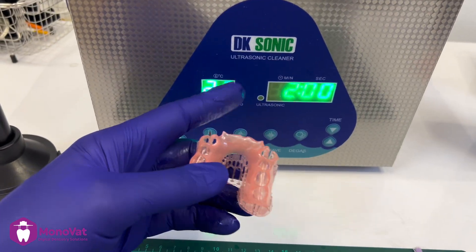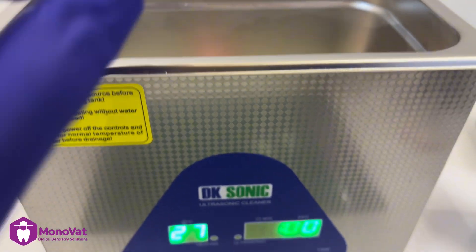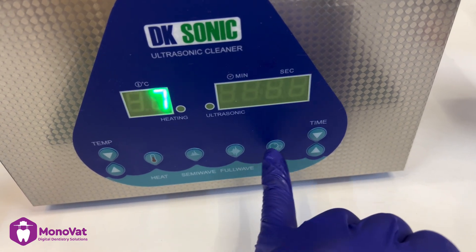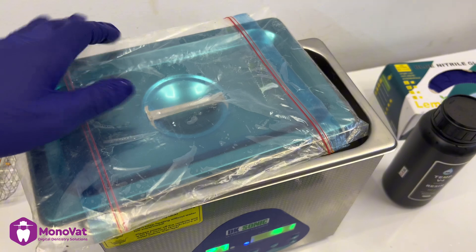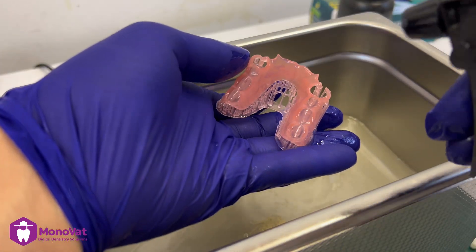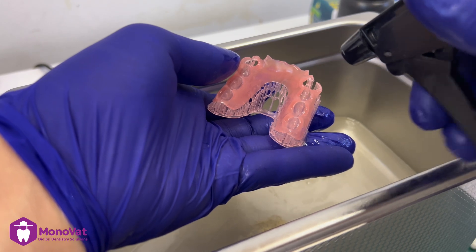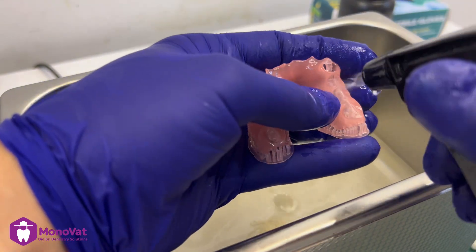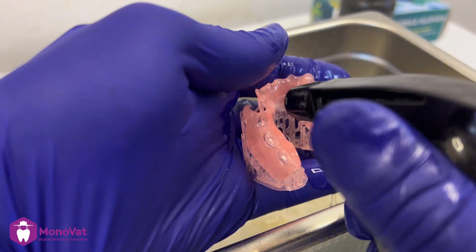For washing, I will use an ultrasonic cleaner with 99% alcohol, or 95% at least, for two minutes. Then after that, I will re-wash it using an alcohol spray to remove any extra resin or particles that could stick on the denture during the wash.